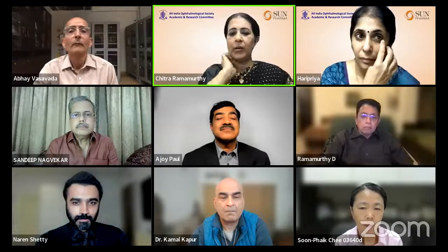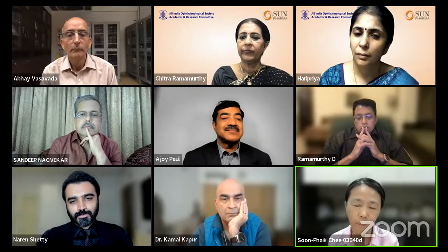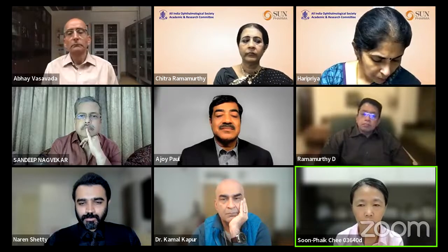Dr. Sufekci, I wanted to ask you, a severe capsular bag phimosis and there is zonular weakness also. What would you suggest? Would you say that we remove the entire bag, or would you have some novel way of doing things? Okay, so I really think it's important to decide whether you want to preserve that lens. So if it's a multifocal lens and the fellow eye already has a multifocal lens and the patient says, can you please try to save my lens? Then I go to the extent of hooking up the bag and dissecting free the subcapsular fibrosis, separating with toothed and non-toothed instruments to peel off the subcapsular fibrosis.